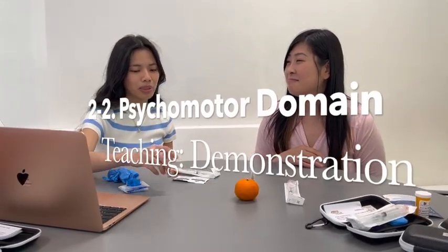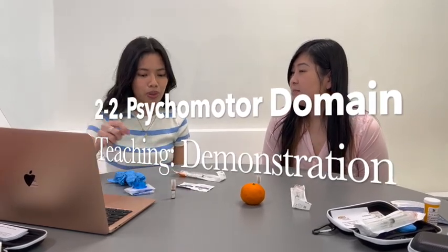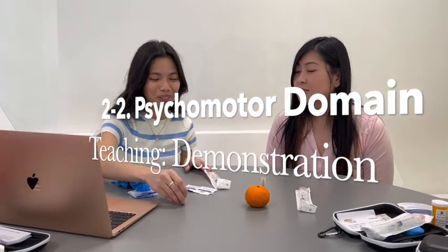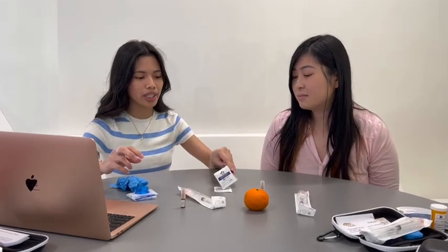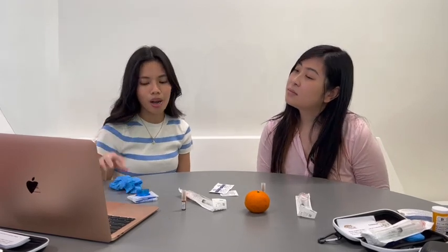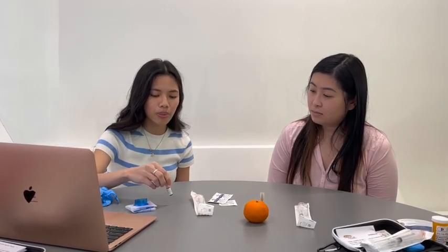All right, so I'll show you how to properly administer naloxone and how to draw the medication out from the ampule. What we need first would be the ampule with the naloxone inside, your syringe, the alcohol swab, which we need to cleanse the skin before injecting, and then gloves to wear, but in an emergency situation, we can skip this part. So I'll pretend it's an emergency situation and I won't be wearing that.